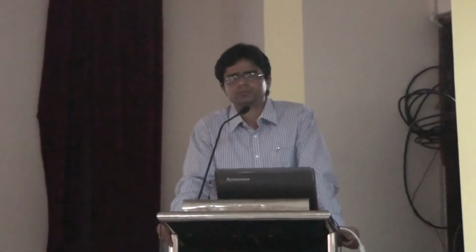Suppose a patient with LVF, you are applying CPAP, then how do you assess whether it is adequate or not? The clinical parameters will improve. There will be decrease in the respiratory rate. The oxygenation level will improve. There will be improvement in the ABG level. We should apply it whenever there is hypoxemia or there is a problem in the ABG level. Not in all patients.